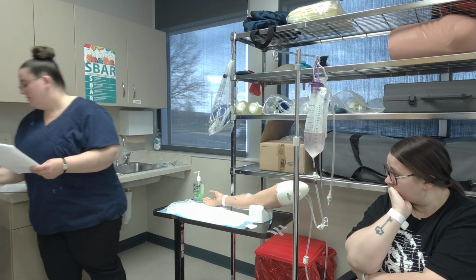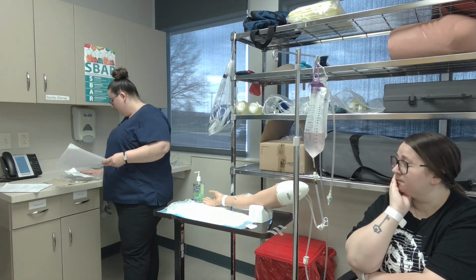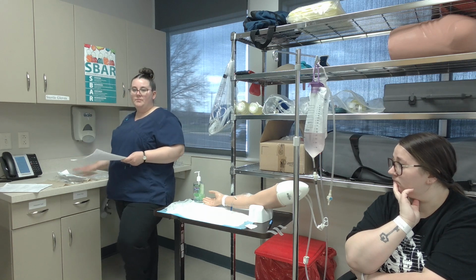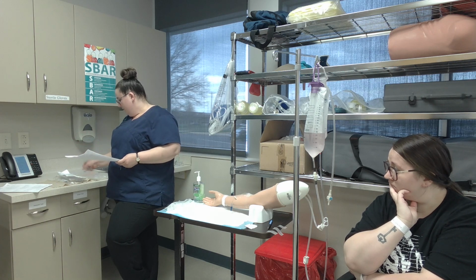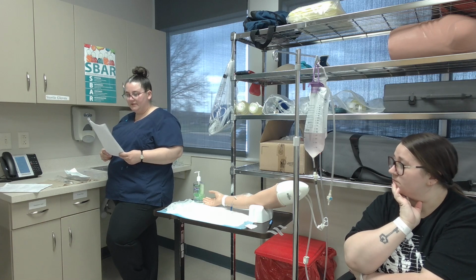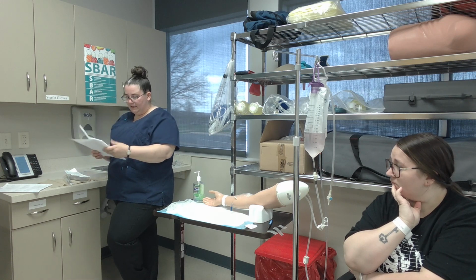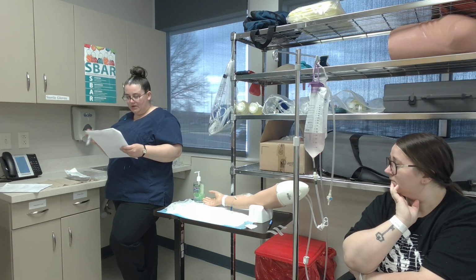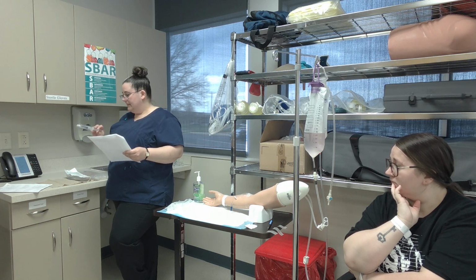I have my MAR out, and I will be doing my first med check with my medications here. So I do have some used medications, so the packaging is open, but in the real world, I would have brand new packaging with no rips or tears or anything like that. I have, for my first med check, Mr. Joseph Smith, date of birth 10/5/1954. And this is my normal saline flush, 3 ml IVP PRN for IV patency. Normal saline flush, 10 ml. I will be only giving 3 ml IVP PRN for IV patency.